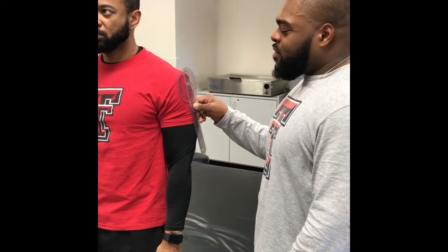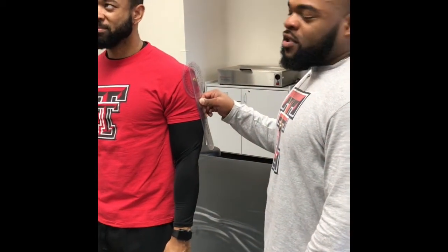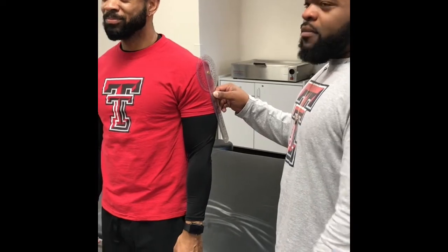Hey, we're about to do some range of motion with the goniometry. First we're going to start off with shoulder flexion, so if you would sir, bring your thumb up to the ceiling.